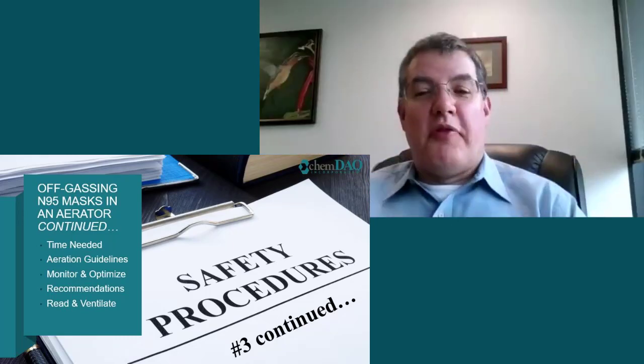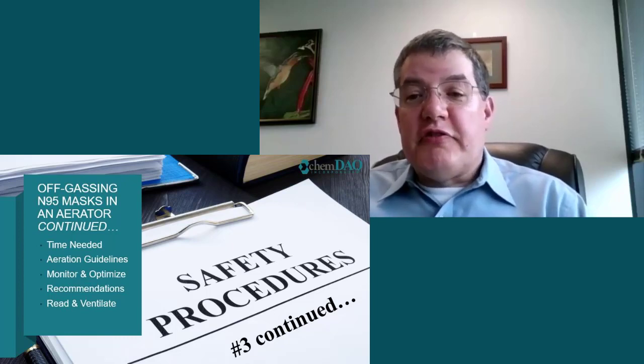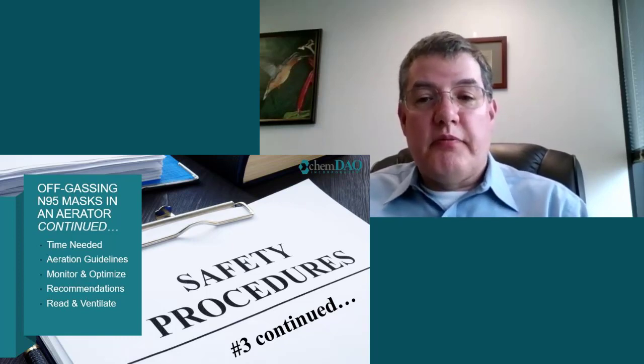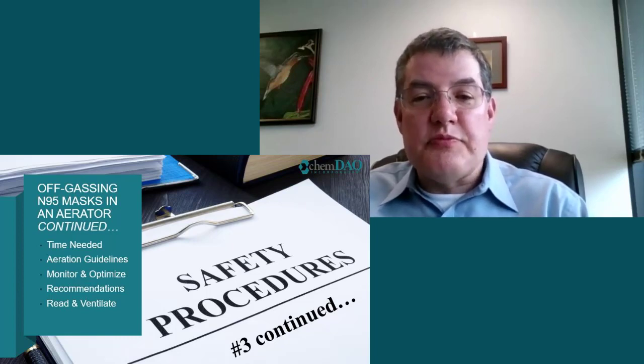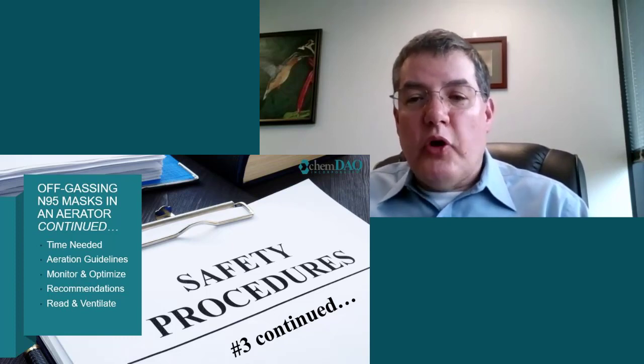Yes, thanks, Bob. This is a very common question that we get. And the answer is that OSHA sets requirements, but normally does not dictate how those requirements are to be met. OSHA's requirement is that employers must ensure that their employees are not exposed to hydrogen peroxide above the OSHA permissible exposure limit. But how employers achieve that is up to them.